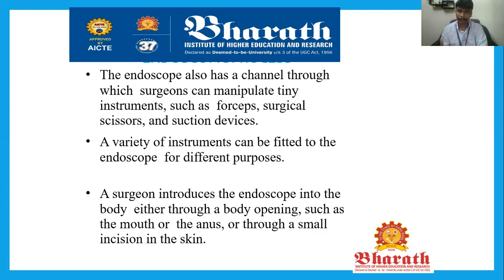So endosurgery is being developed in all countries, and it is being done without any cutting or coagulating. Endoscopy is being widely used in ENT departments to view the internal structure of the ears and the mouth wall. For every internal view structure, people are using endoscopy. So surgeons are using endoscopy for surgery without any cut or coagulating on the external surface of the human body.